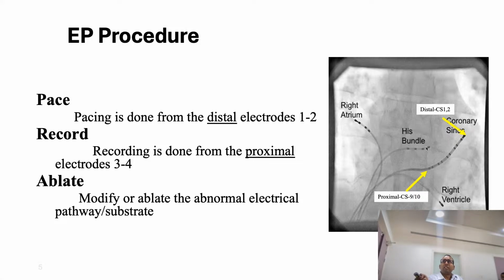So if it is there, it will be H his one. 1, 2, 3, 4. We are reading the EGMs which is coming on the monitor. We should be knowing that 4 means it will be somewhere here. So these signals we have to see, and then we have to see the one first signal. Both we have to correlate, and we have to make conclusions.